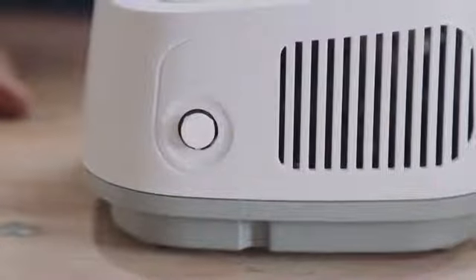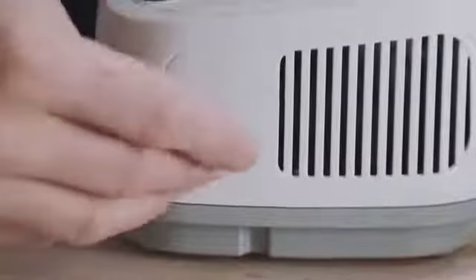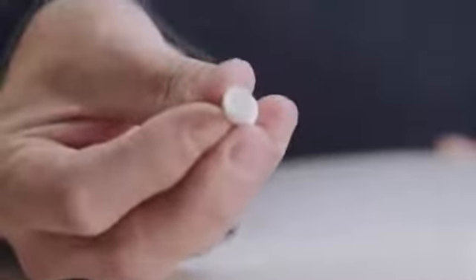The filter should be checked regularly and replaced when it becomes discoloured or dirty, clogged or wet. To change the filter, remove the white filter cap by gently pulling it out. When replacing the filter, make sure it's fully inserted. Don't wash or reuse the filter, and don't use the unit without one.